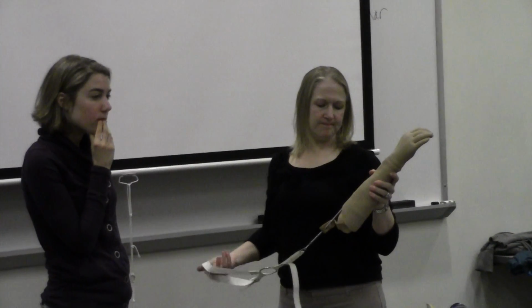Outside of the body-powered conventional prosthesis, this is also a conventional body-powered prosthesis, but it has more of a cosmetic hand. This would be more for someone that doesn't really want fine motor skills with the terminal device because it adds bulk, but they do have a little more of a cosmetic appearance. So you might find someone using this that works in a bank or something like that that needs to have that appearance. It's pretty bulky and it just doesn't have that fine motor ability. Outside of the conventional, we have a passive device. They can pick things up, using it just as an assistive device, with a more cosmetic appearance.